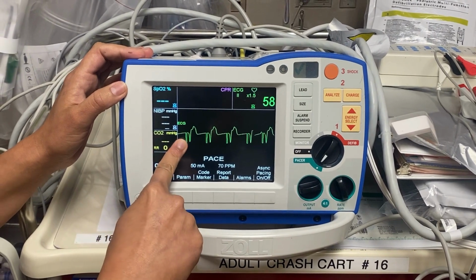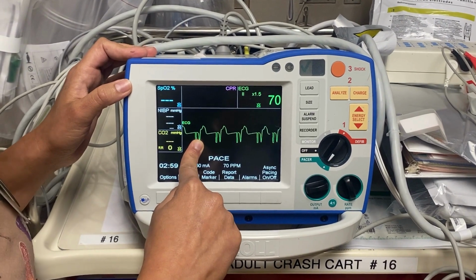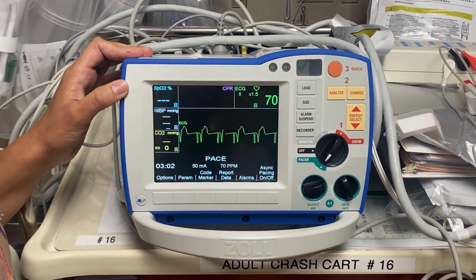Just want to repeat, the capture will be shown as downward spikes followed by a widened QRS complex, and it's going to be an extended T wave.